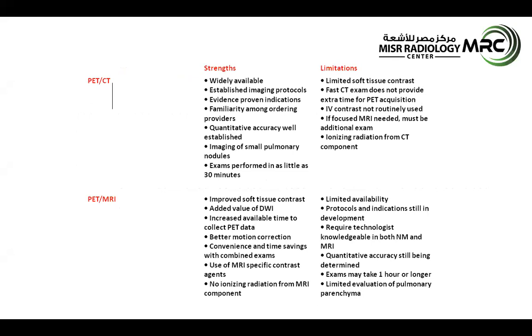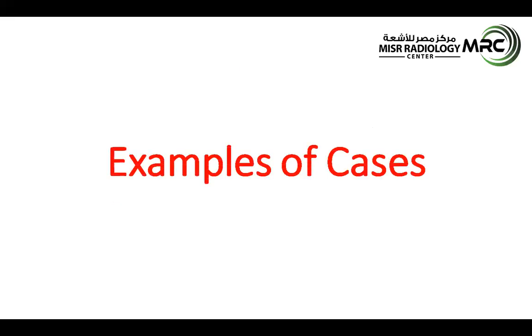I won't go deep into the differentiation between PET-CT and PET-MRI. Now, the essence of this talk is to highlight the importance of PET-MRI and when to order it, for which patient or for whom of the oncological patients. I'm going to show you some examples of cases performed over the past year in our center to highlight the role of PET-MRI, where it has an edge, and how it has been helpful in assessing and staging patients.